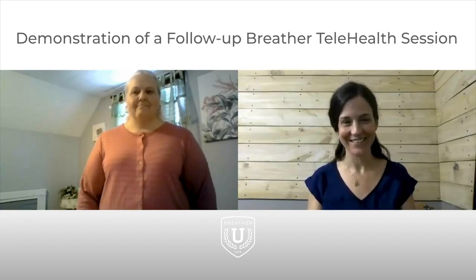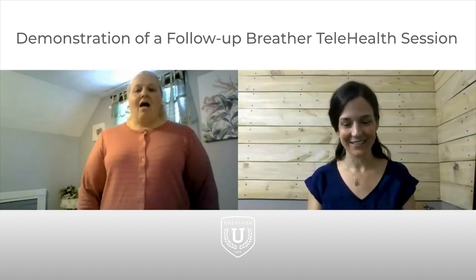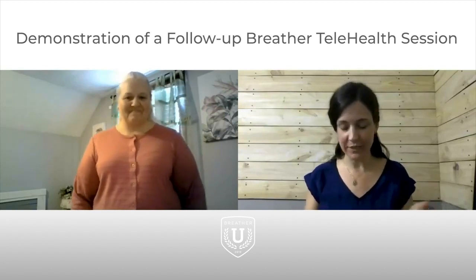Let's try one more time. Hang on. Let me get, I'm ready. Okay. I feel like I'm competing with myself. You are. Good. 7 again. So we're going to put 7 down for your new maximum phonation time. So you have a new personal best.